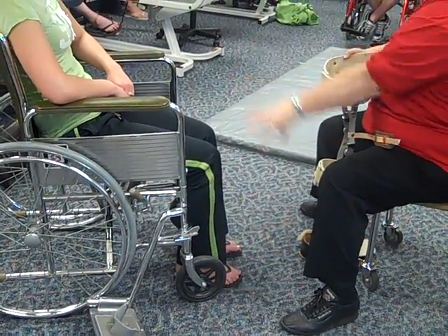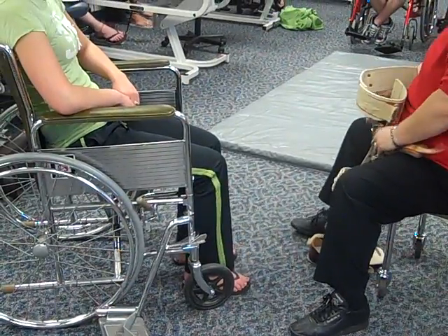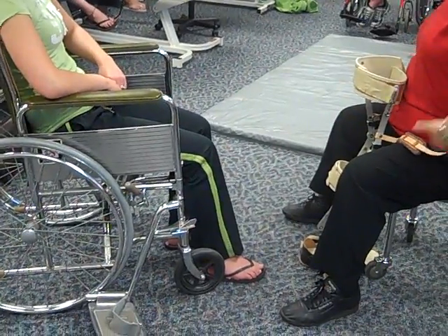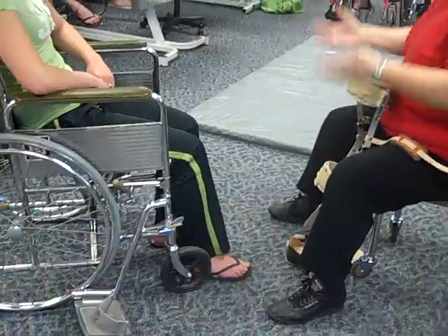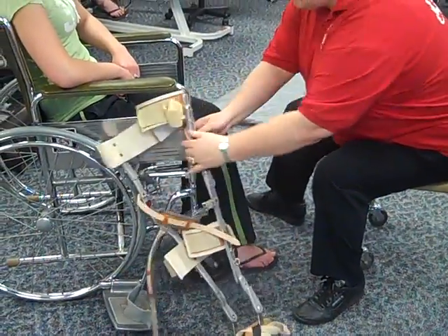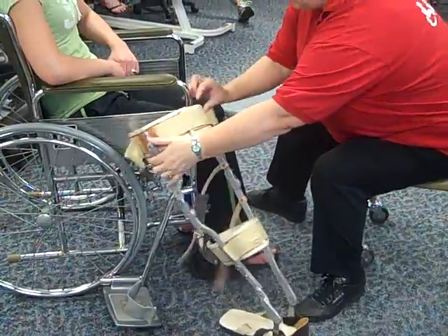For the camera, I think I'm going to use this leg. First thing I'm going to do is get this underneath your leg, so just relax. She's paralyzed from the waist down so she can't help lift that leg up — try to keep it as dead weight as possible. Let me put this over to the side and make sure it's not going to fall.